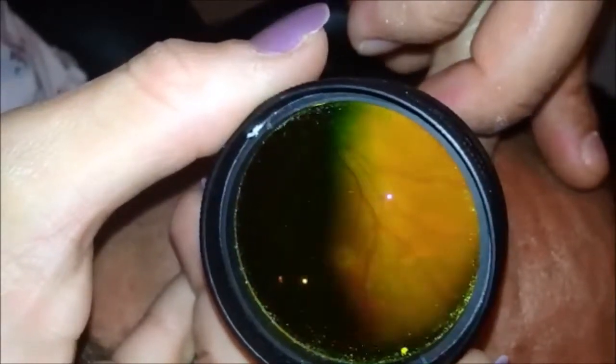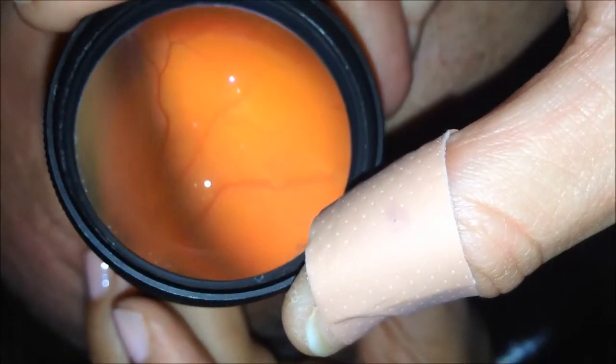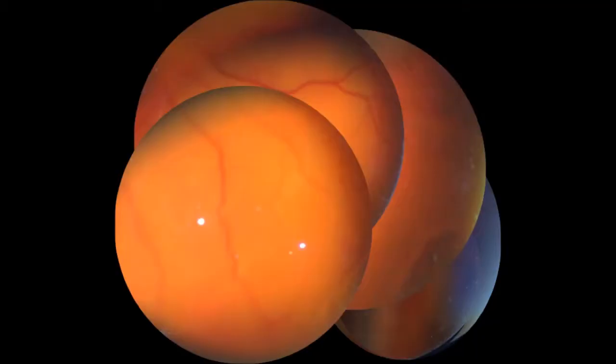In cases of rhegmatogenous retinal detachments, you can also identify the causative lesion and create a montage with the video images that you have taken. The final montage can be used for clinical documentation purposes, as you can see here.